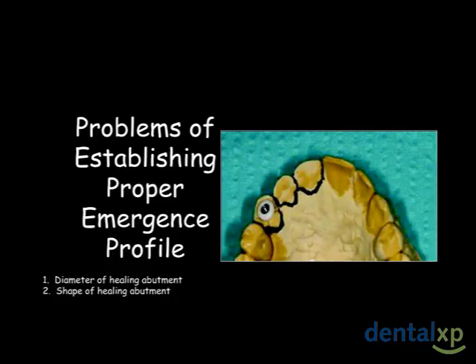This presentation will present 3 cases to show techniques in creating a proper emergence profile. In addition, a technique will be presented to reduce gingival excess cement on cemented implant crowns.